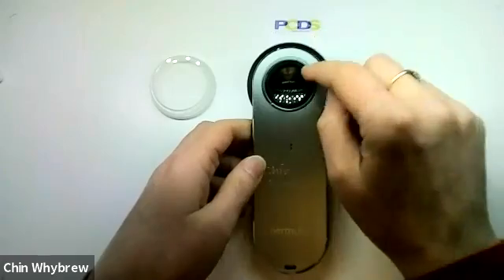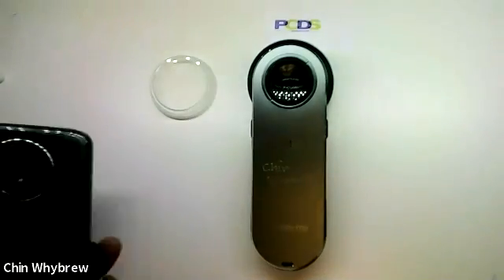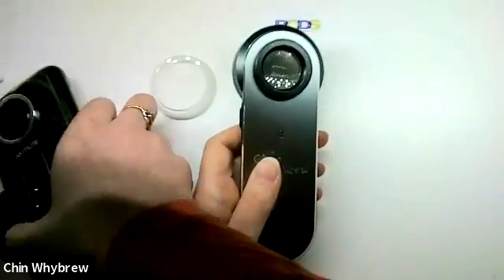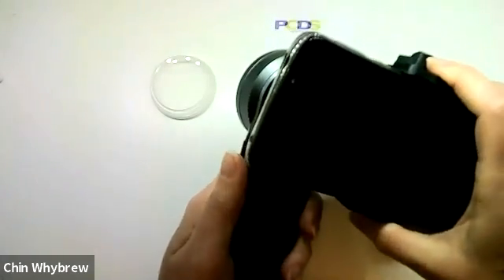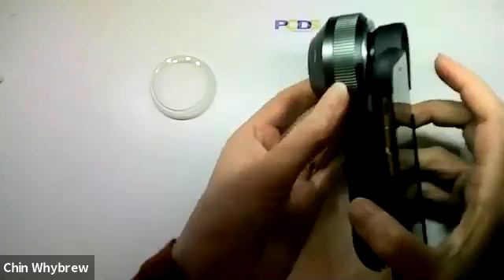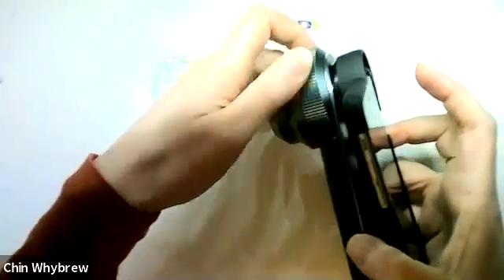The standard DL3 comes with a thread there so that the magnetic adapter won't attach directly. However, if you buy one of the universal adapters, it comes with this little metal ring — you just screw it on like that, so that now you can attach your phone to it. One of the big advantages of this type of dermatoscope is that when you have your phone attached, it is still easy to focus the scope because it's got this nice big section to hold on to in order to extend and retract the end plate.